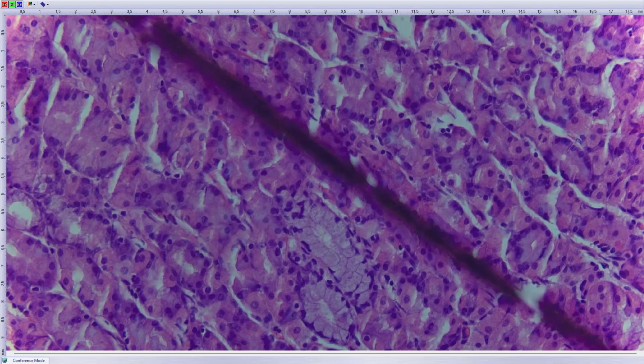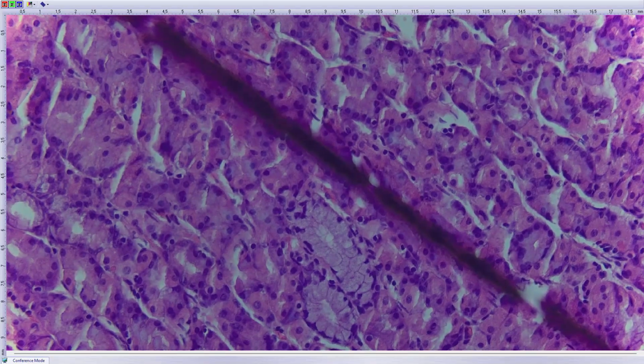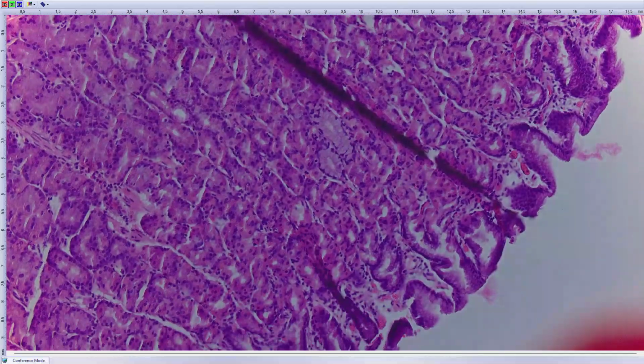Maybe we should be more careful with lesions. Can you imagine if you neglected the grossing, laying only a few blocks? You would miss the cancer very easily, and the patient would leave. I have nothing, I'm safe, but she's not safe. So the moral of the story in this case is always submit the whole stomach, and this is really in the guidelines.